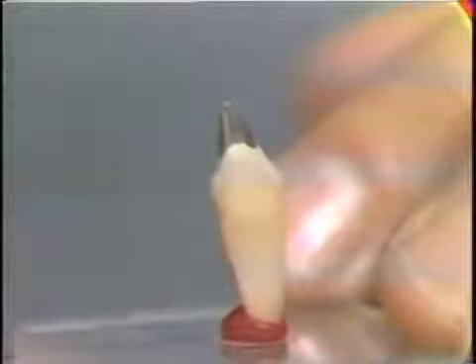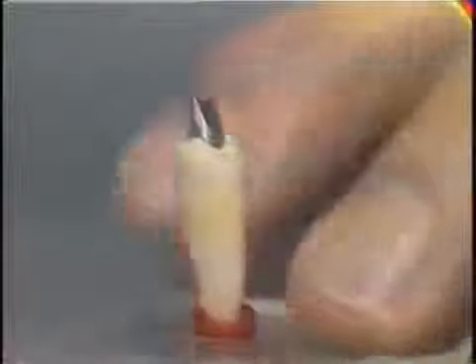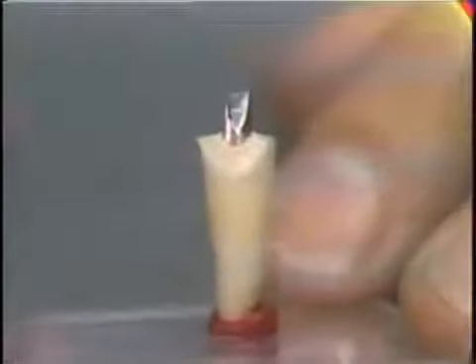If we turn now to the other model which we looked at the beginning, which shows the finished cemented preparation, and we take a close look at this, you can see, I think, the finished outline. On the left-hand side of the screen is the labial surface, on the right-hand side is the lingual surface, and you can notice now that the incisal is much thinner than it was previously, and I think you can recognize that it now has something of the shape of the regular veneer crown preparation as it's done on a vital tooth.